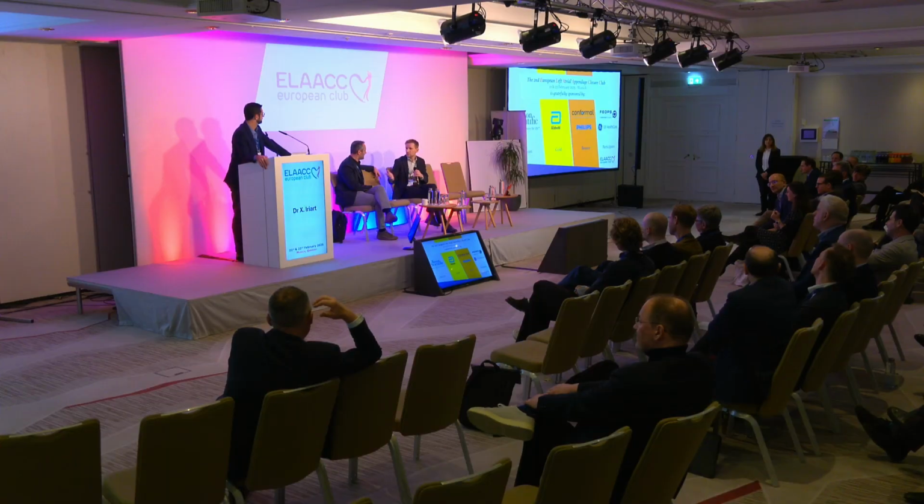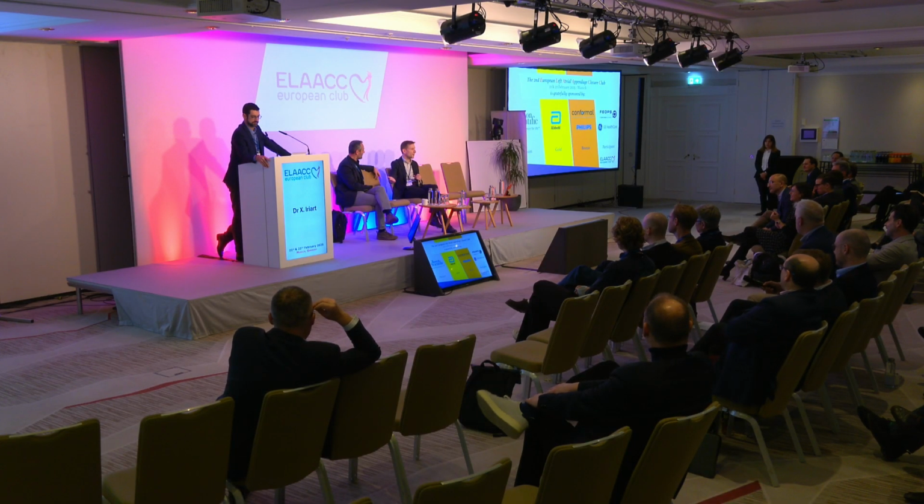Do you prefer to have a TEE or a coronary angio? I'm happy to have right now on the podium a coronary angio, but not a TEE, to be honest. But do you understand what I mean? Most of the people, for sure in the US also, have TEE during the procedure. So why would you do the same TEE before? It doesn't give you any additional information.